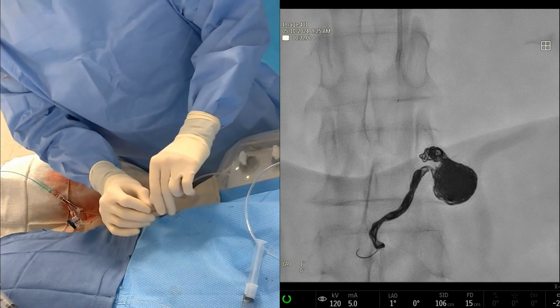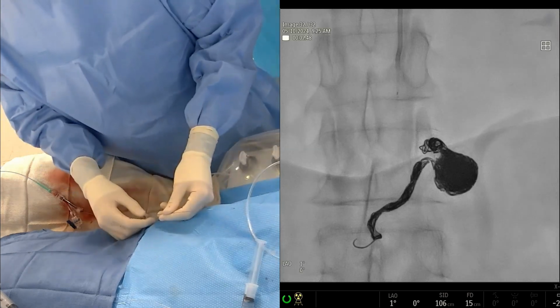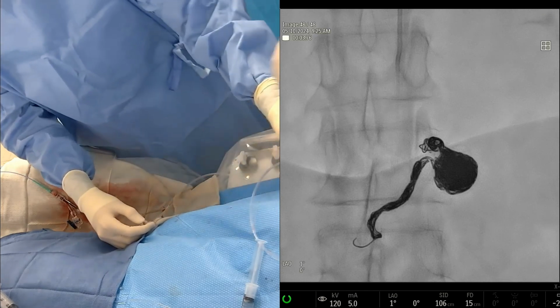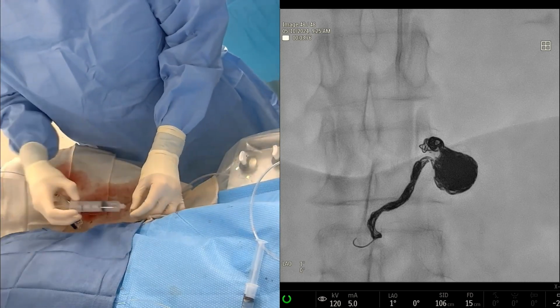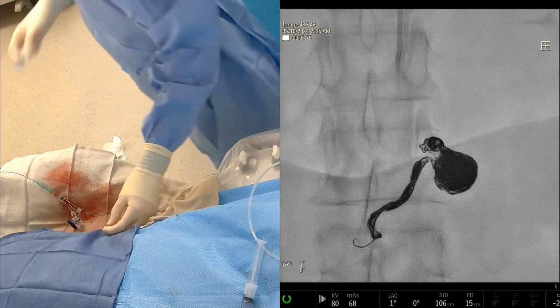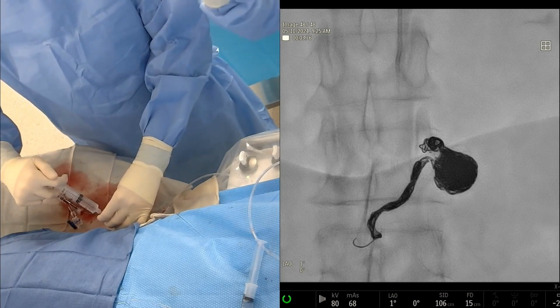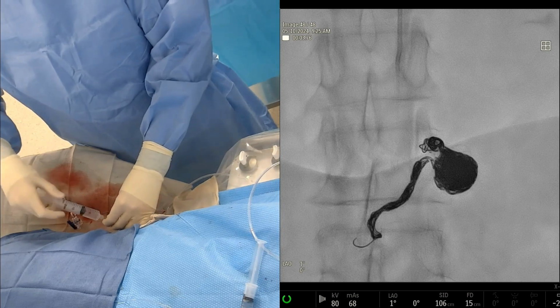In terms of the length, it's sort of a guess. You look at what the last coil did and go from there. So maybe put a smaller one, like a 4. We can still fill that space with the same length, but what if you take a 420 or something like that and put it inside that gap? Exactly. I asked about the coil size because I might have done smaller. It looks a little bit oversized, right, Gary? I think a 4 or 5 filling the gap would be better.